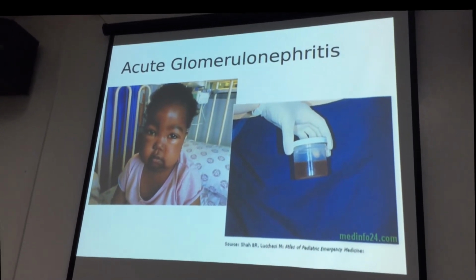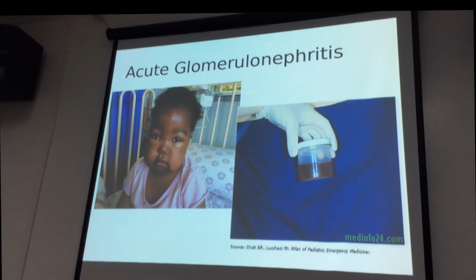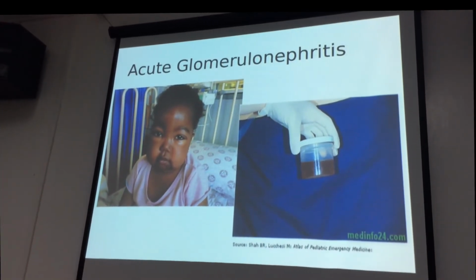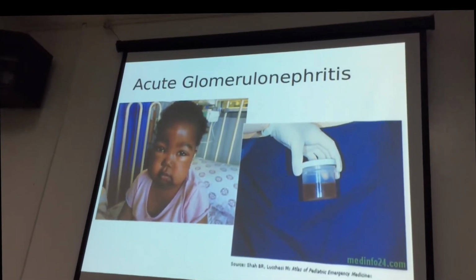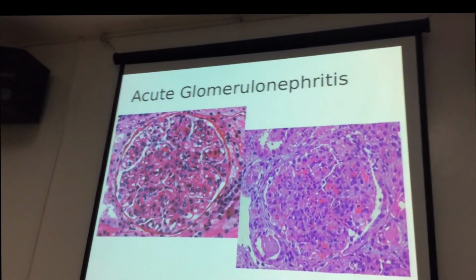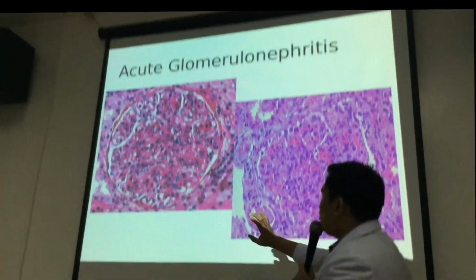Hypertension. Yeah, why will the patient or why will the child manifest? Low perfusion. Kidney low perfusion. And then, what happens when there is low perfusion? Will cause the kidney to produce lots of renin. Very good. 5 points. So, microscopically, this is what you will find.